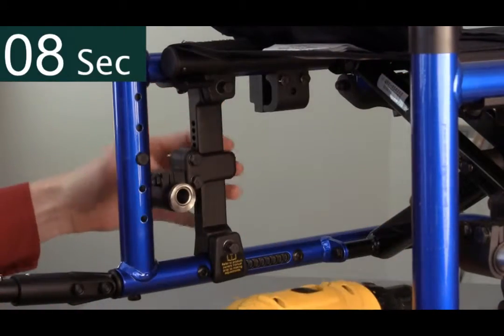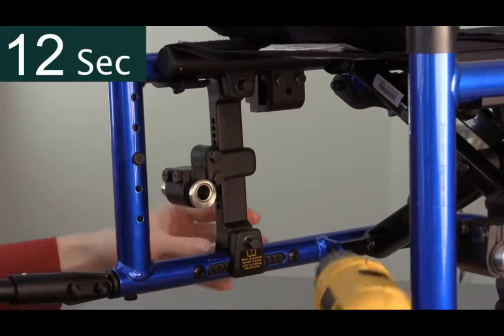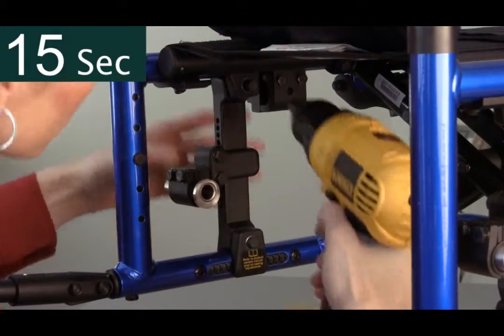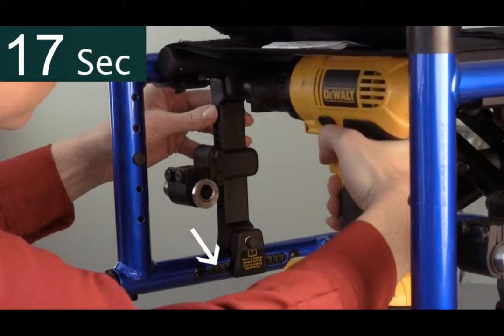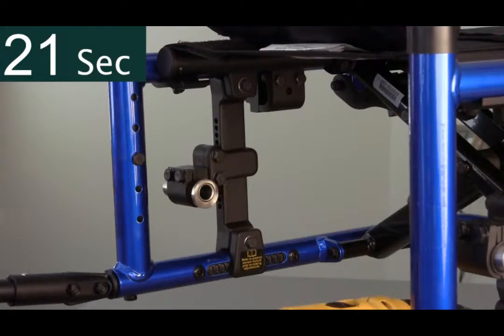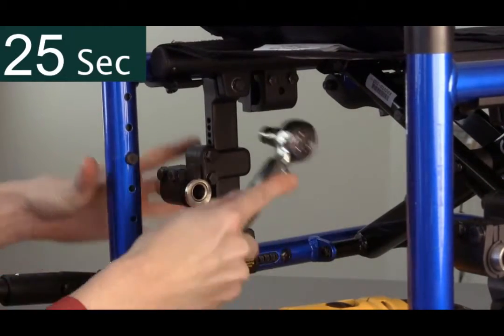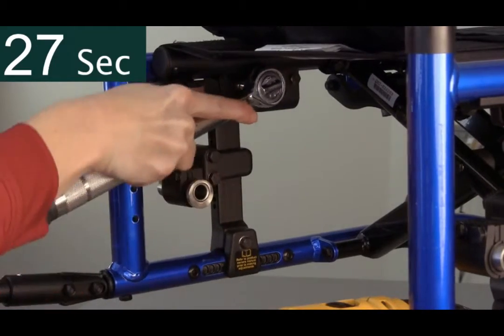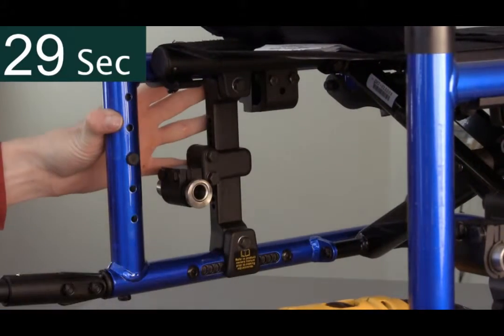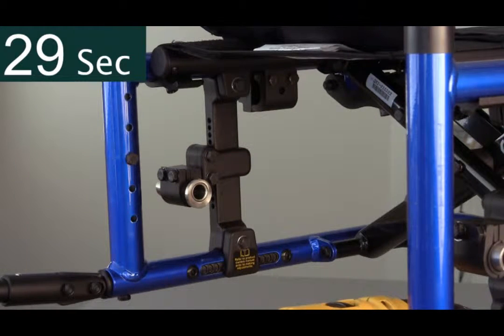Once loosened, the clamp is free to move on the upper frame and the indexed clamp is free to move on the lower frame. The indexed positions are in quarter-inch increments. Once the plate has been moved to a new desired position, re-tighten both bolts with a torque wrench and ensure the clamp is on straight. It is important to always do the final tighten with a torque wrench to ensure proper tension. Consult the owner's manual for torque specifications.